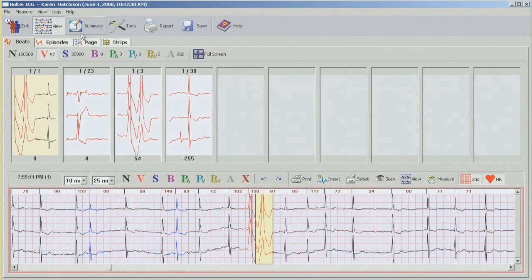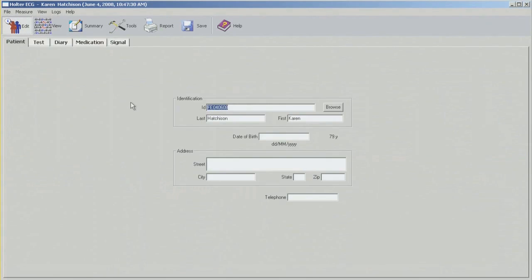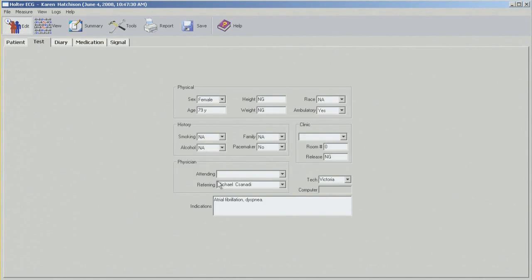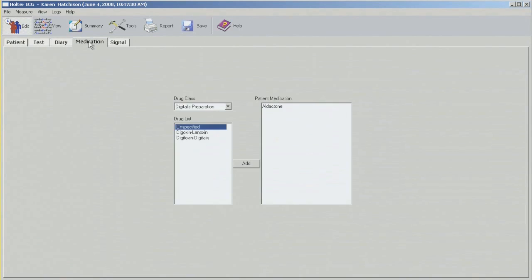I'm going to start working from left to right, first with editing. This is where we can edit all the patient information, all the demographics, reason for a test, referring physician. You can enter diary symptoms, time and medication.